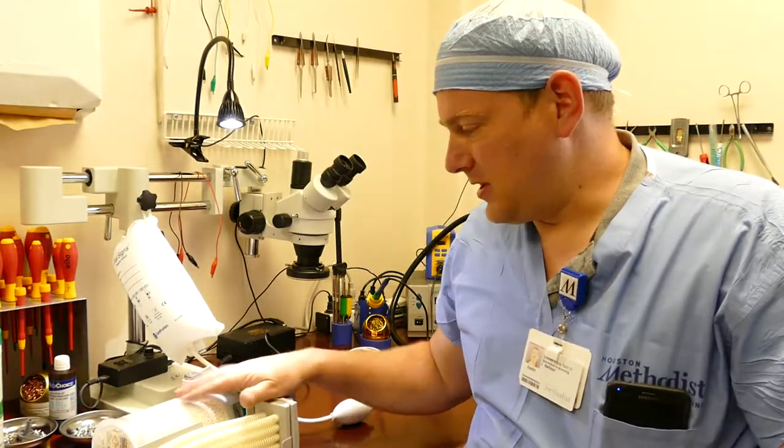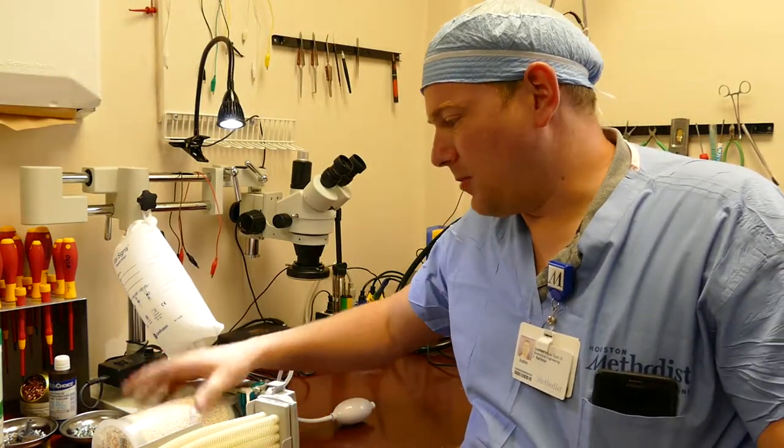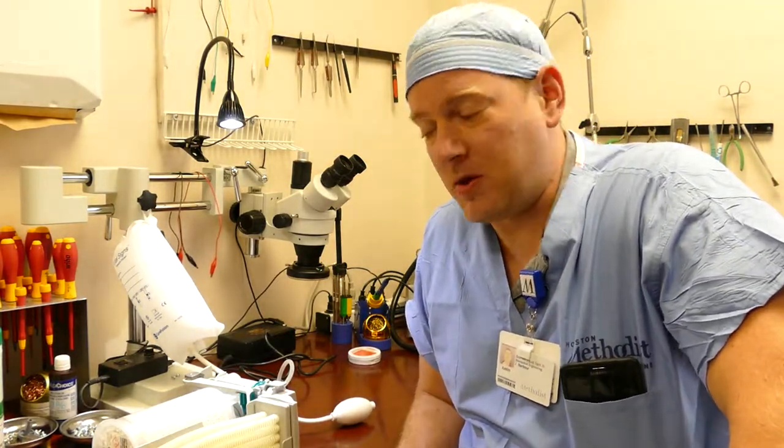Hi everyone, welcome back to A Better Biomed. Today I'd like to go over a fast and simple topic about leak testing anesthesia components and making jigs to create those tests. What we have here is a GE anesthesia component — an absorber and a moisture separator — and this one was believed to be faulty so it was removed from the equipment.